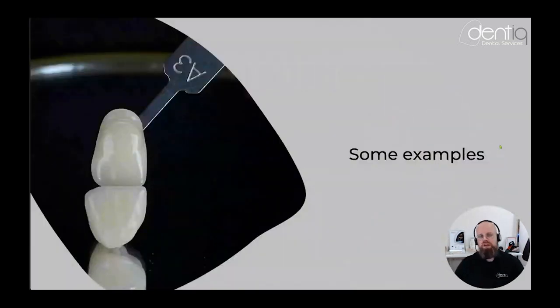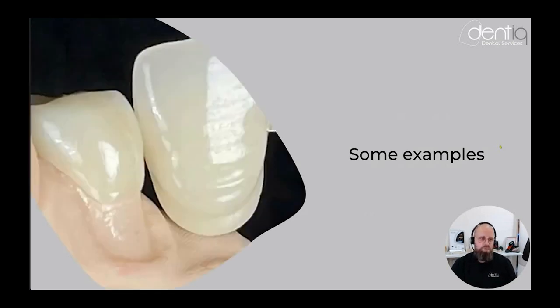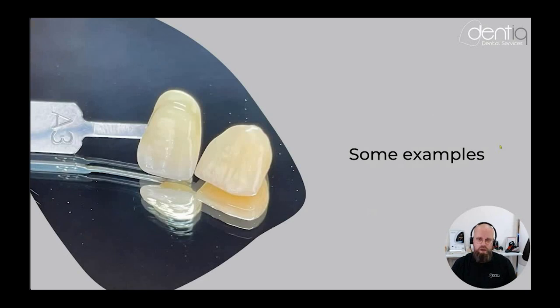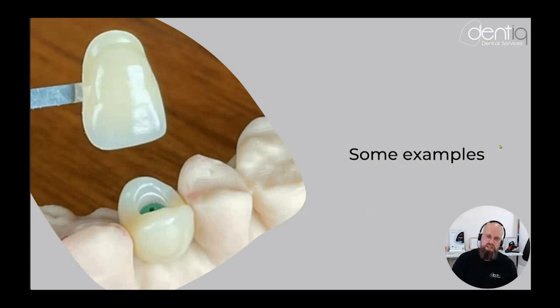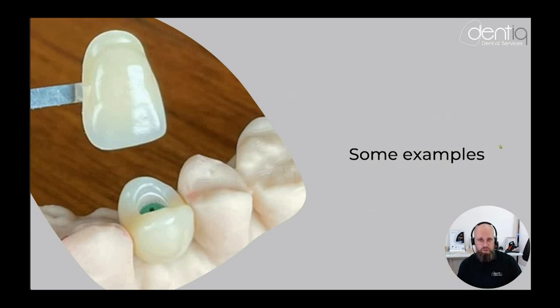Let me show some examples. This A3 crown came straight out of the printer — I just polished it. Another beautiful A3, straight from the printer, polished and ready to go. Here's an interesting case using Ceramax implants from Switzerland: a fully metal-free system with a zirconia implant body, zirconia base, carbon fiber screw, and a metal-free holistic crown on top — a completely metal-free restoration.